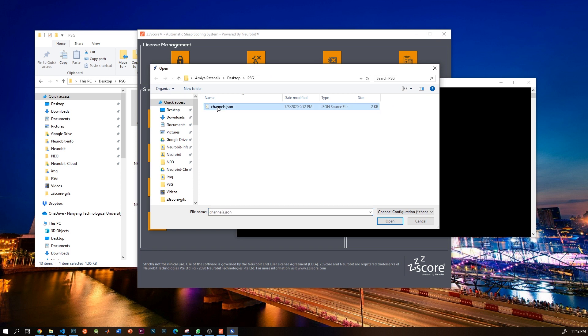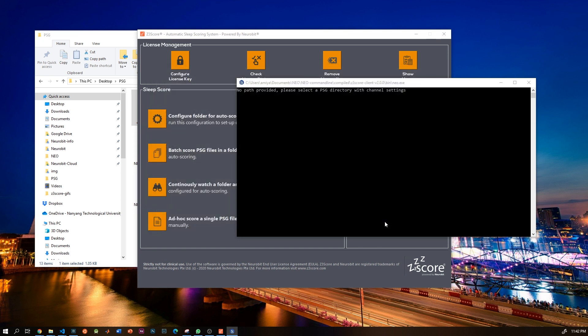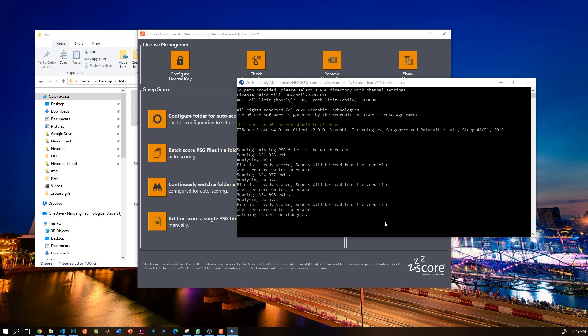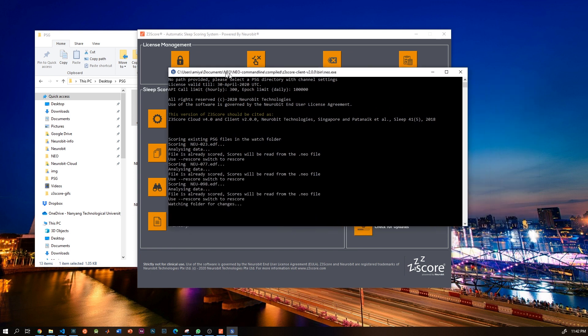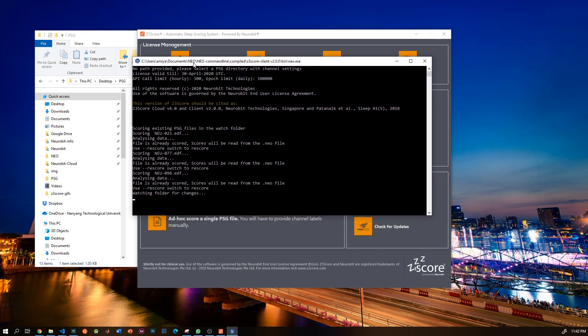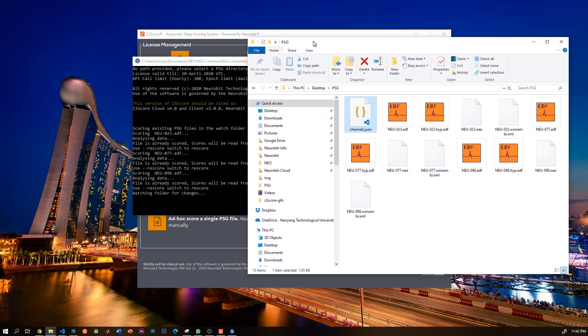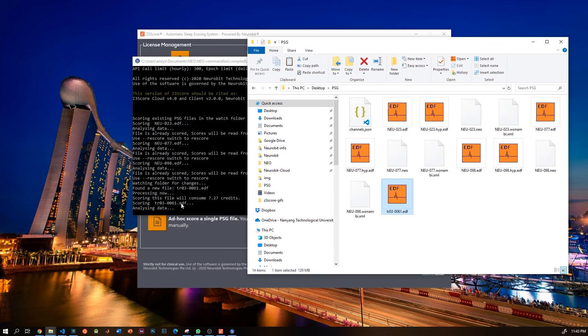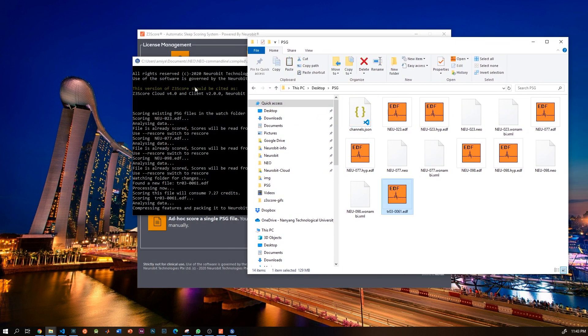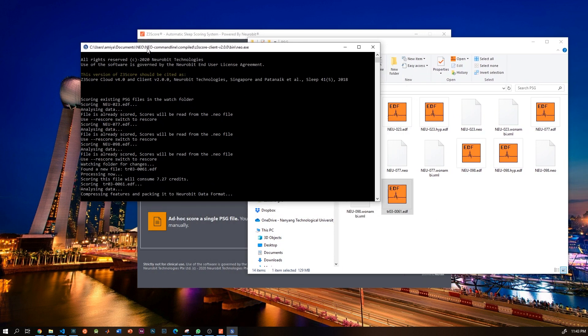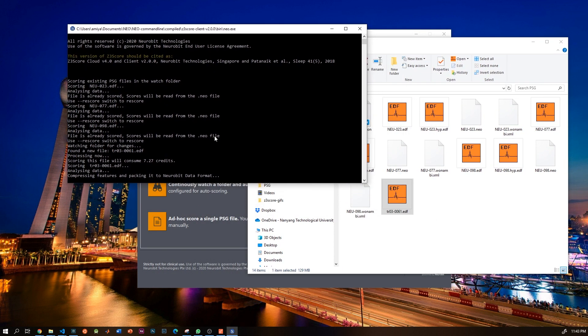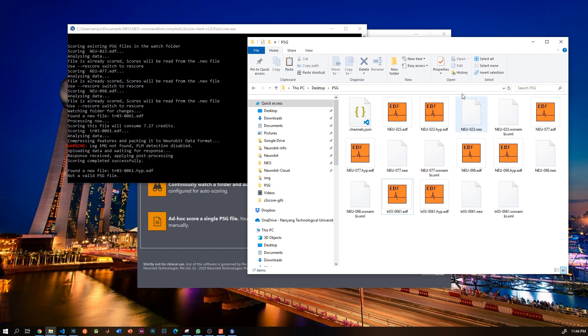So now as you can see, z3score is watching this folder. Let me paste a new EDF file here, and as soon as it appears, the scoring begins and it is scored.